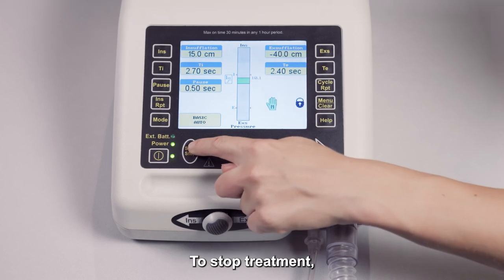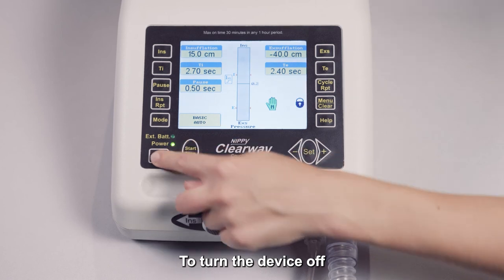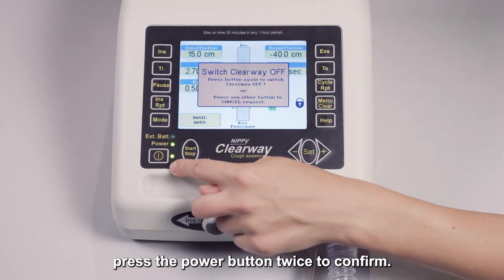To stop treatment, press the start/stop button again. To turn the device off, press the power button twice to confirm.